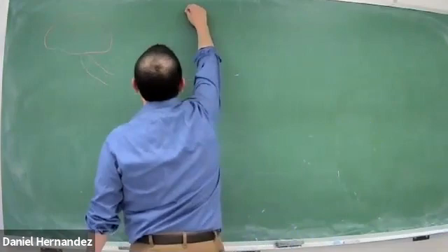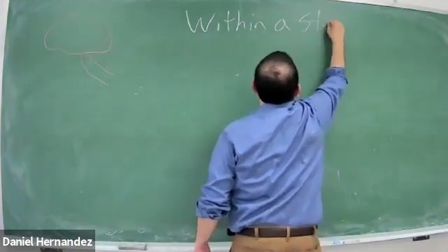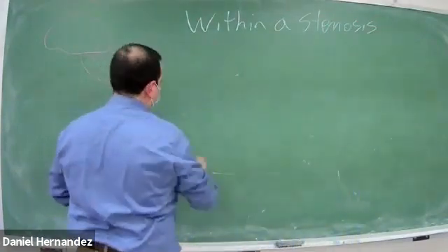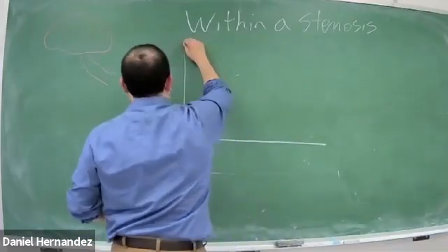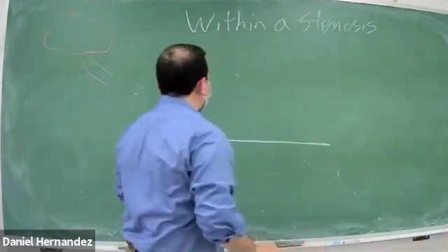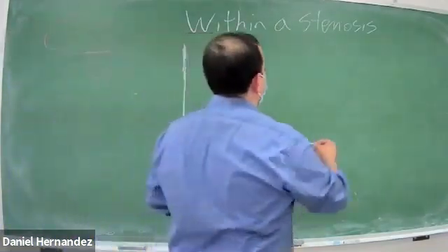So now we're gonna call this a stenosis. So as we're approaching that stenotic lesion, velocities are going to begin to increase.